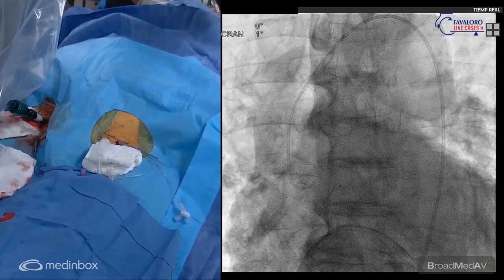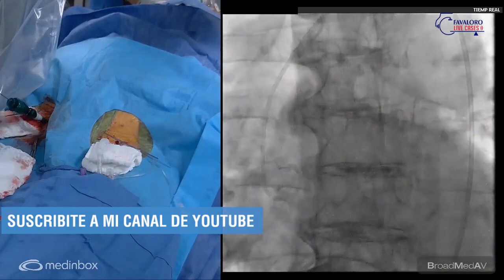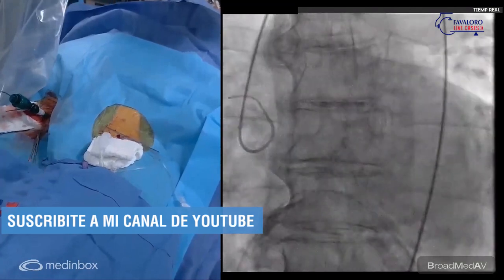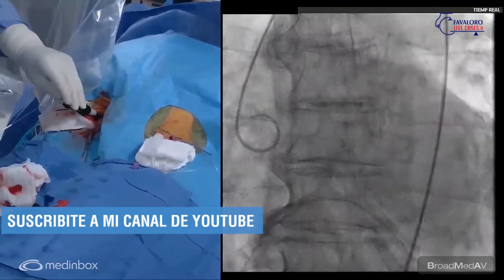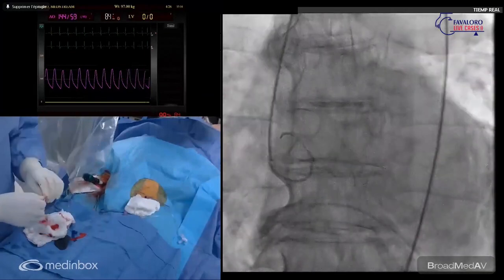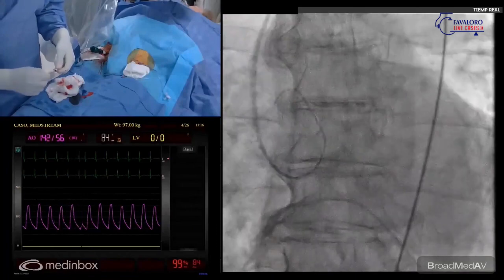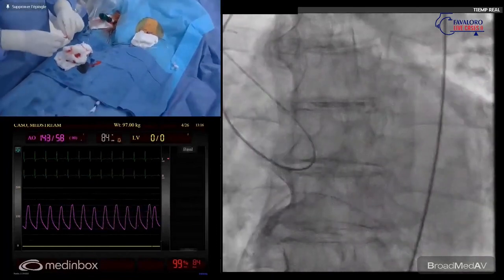You have to take some time. You know that. Why I'm doing this is because at the beginning we had problems with wires, with all the wires, and before we had dedicated wires, so we were scared about that. So we try to be as less aggressive as we can. We try to go to the apex of the valve there, like something like this. In most of the cases we can, but some days we have to change to the regular technique.